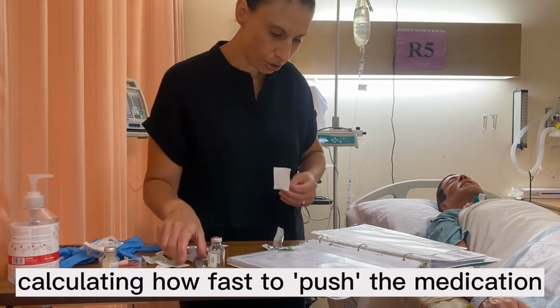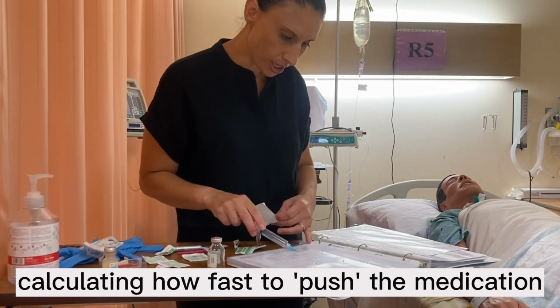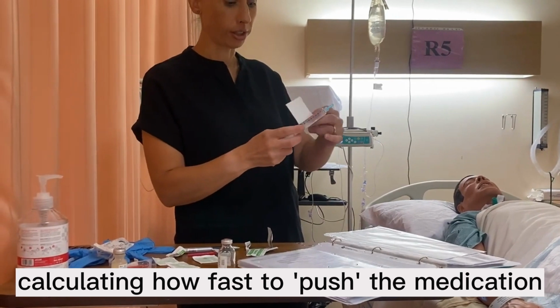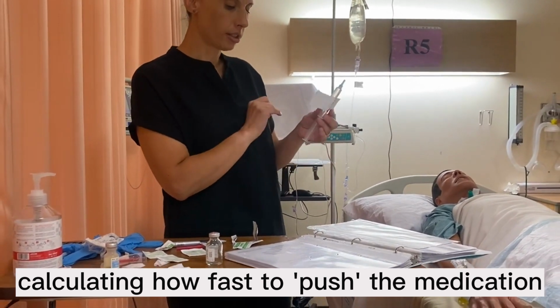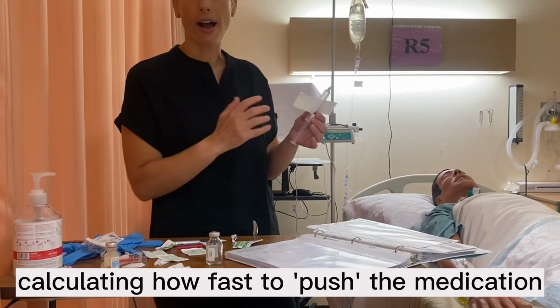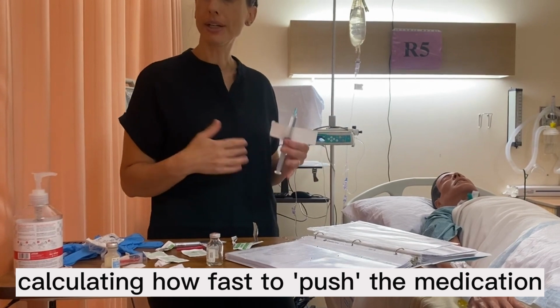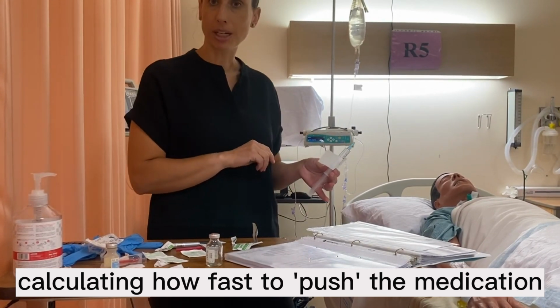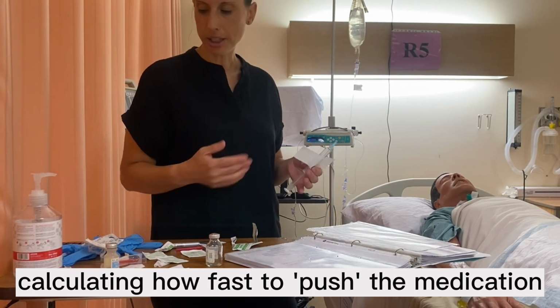Also important to notice as well, how fast can I give this? So we're gonna take a look at over 3 to 5 minutes. So we're gonna have to do a bit of a calculation there. So I calculated I have 10 mls. I'm gonna give it over 5 minutes. Because this patient has not had this medication before, I'm gonna give it nice and slow so I can watch for any reactions. If they had this medication before, I might wanna give it a bit faster, over 3 minutes. So it's completely up to you.